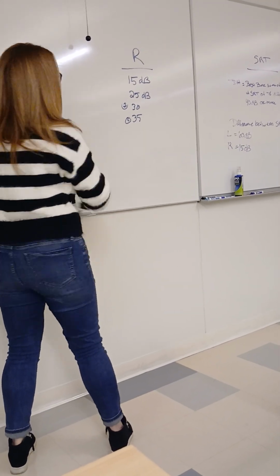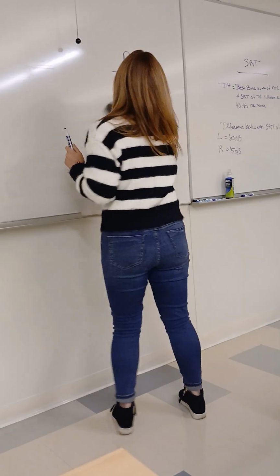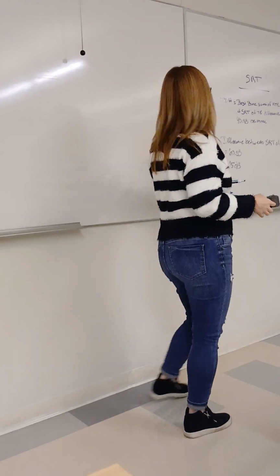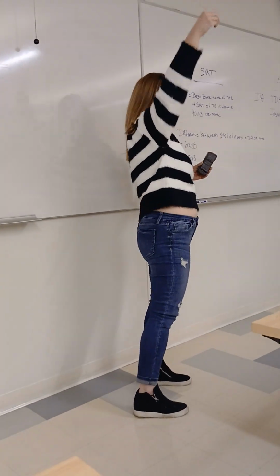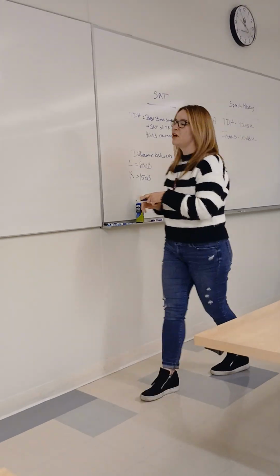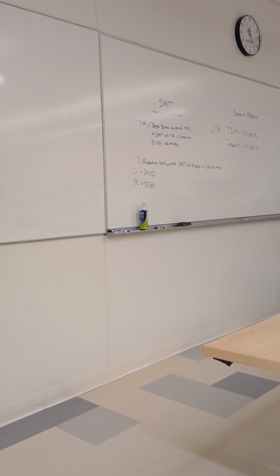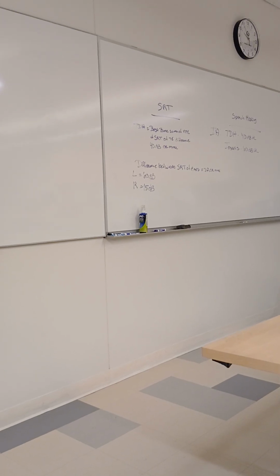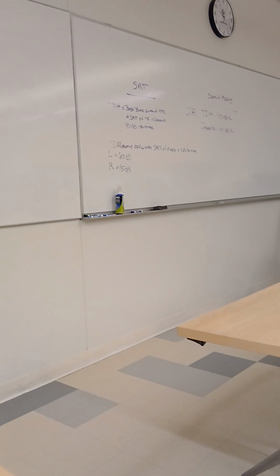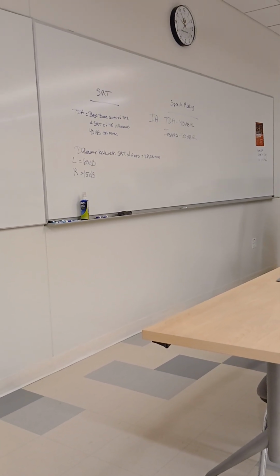Word recognition is the easiest of all of them. Again, not very often you're gonna have to do it. But you might actually have to do more math for word recognition than SRT because you're going up a certain amount. So word recognition, same interaural attenuation, so you're 40 and you're 65. Okay, so let's say our SRT, left, right.